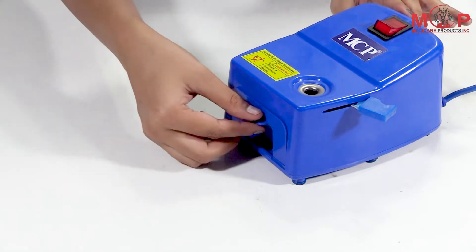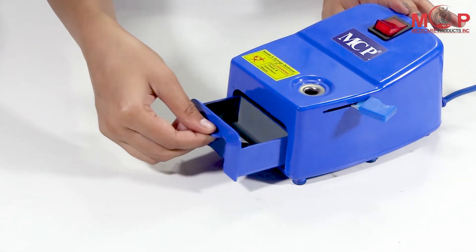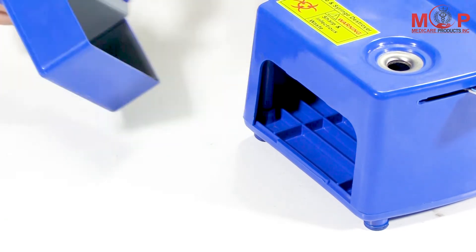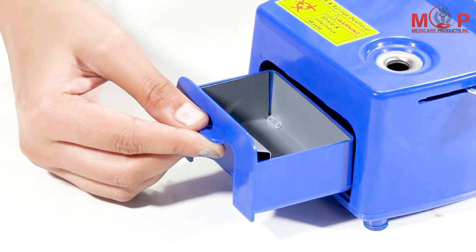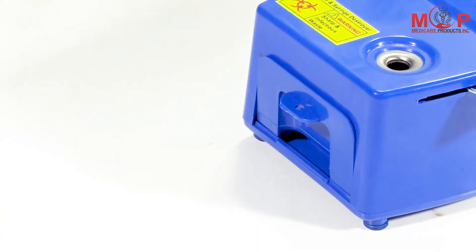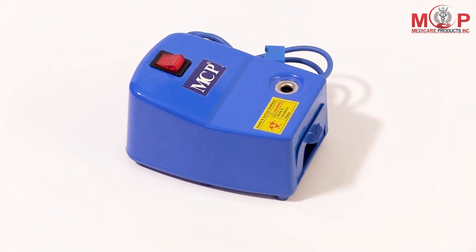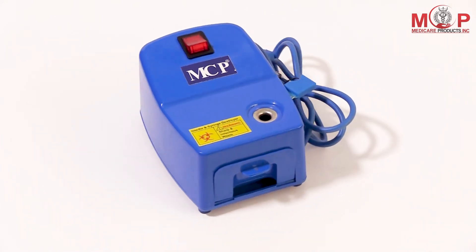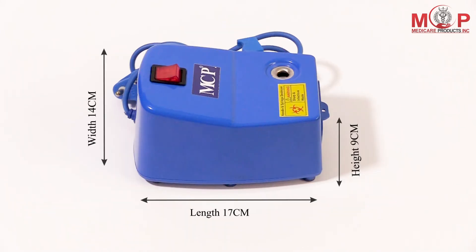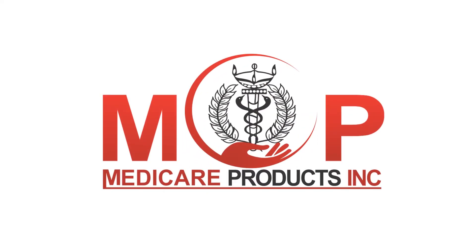All the waste will be collected in the waste box which has a capacity of around 100 ml. This model has copper mortar and shockproof ABS body. It works on very low power. Note: the cutter is suitable for 18 to 28 gauge syringes only.